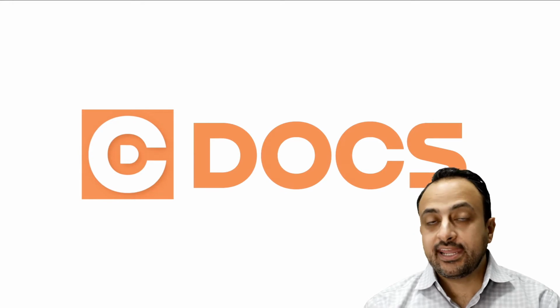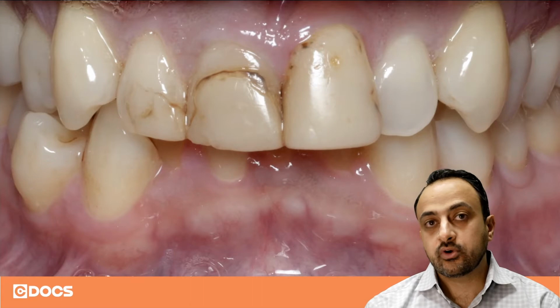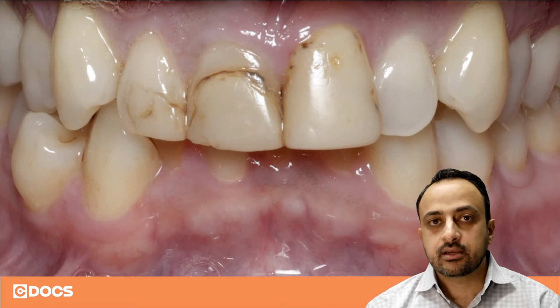Today I want to talk about anterior cases, specifically when working with a laboratory, and a couple of ways that you can help guide your preparations so you're only reducing the areas that need reduction. So here's a case I completed recently.